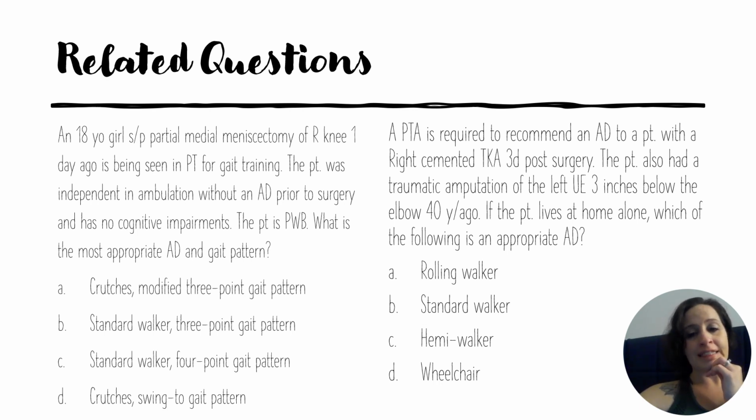Keep in mind that your cemented total knee arthroplasty typically has a weight bearing status of weight bearing as tolerated or full weight bearing. If it said non-cemented in there, then that patient might be non-weight bearing and your hemi walker might not work. It might have been a wheelchair. If it said non-cemented, non-weight bearing, the answer could have been D, but it says cemented, and cemented people typically are walking and are practically full weight bearing right away, okay, in your total knees. That is something that you learned in musculoskeletal rehab, the cemented versus non-cemented arthroplasties. So the condition does give you a little bit of information, even though you might not have noticed that it did, but it does, okay?